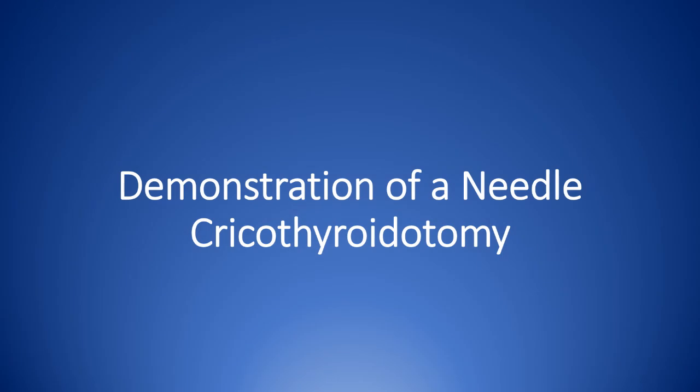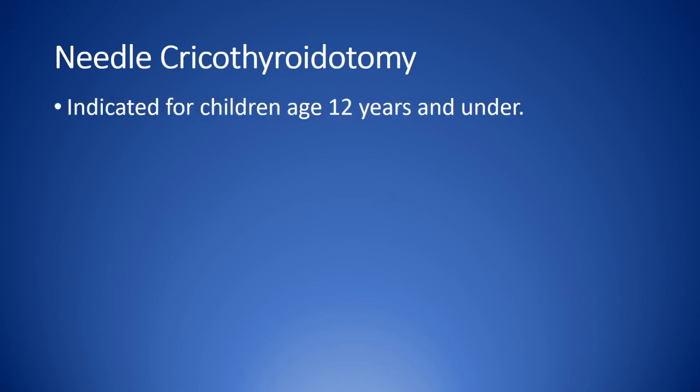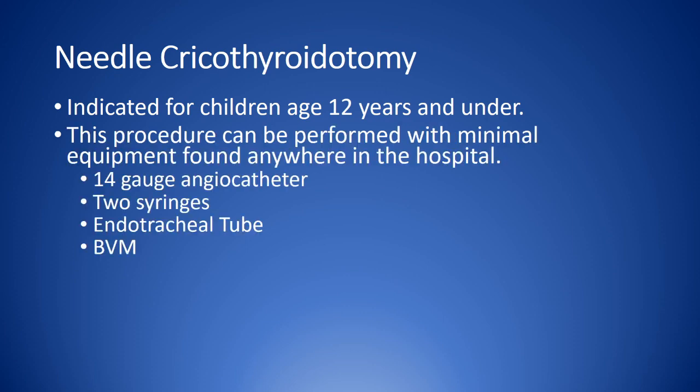At this time, we're going to demonstrate a needle cricothyroidotomy. A needle cric is performed on children. The indication is for children 12 and under. In this age group, you would not be doing an open surgical cricothyroidotomy. The recommendation would be to do a needle cricothyroidotomy.